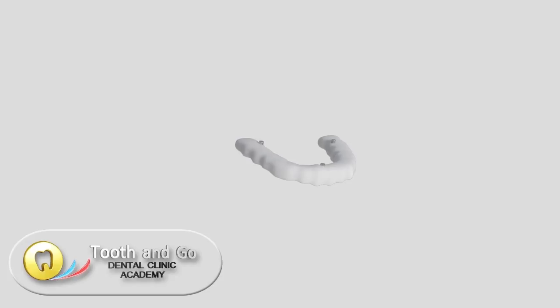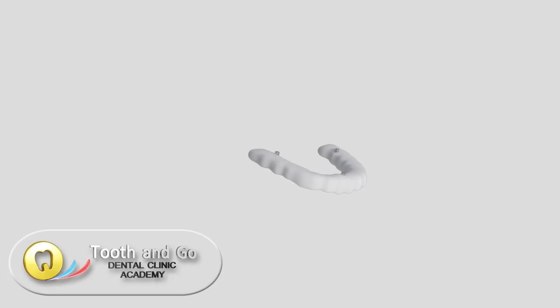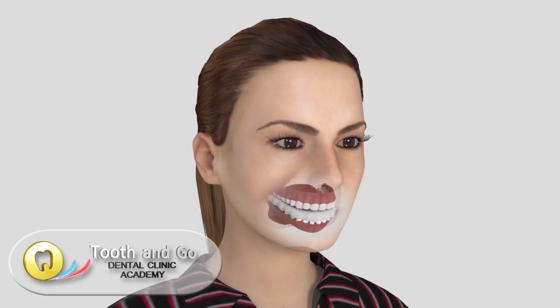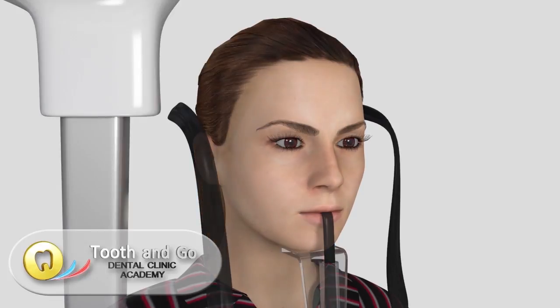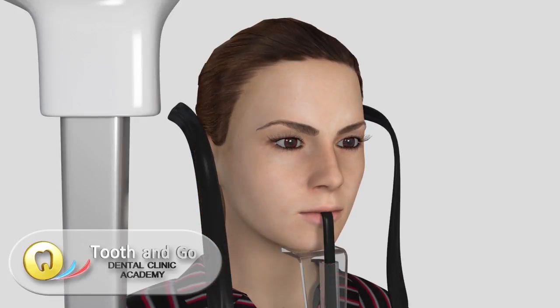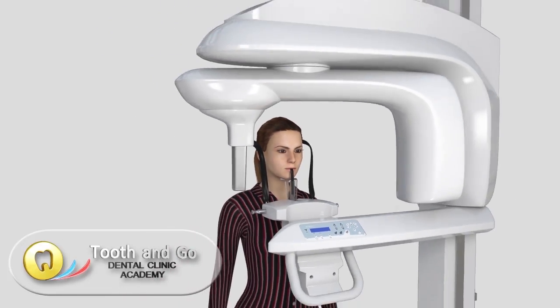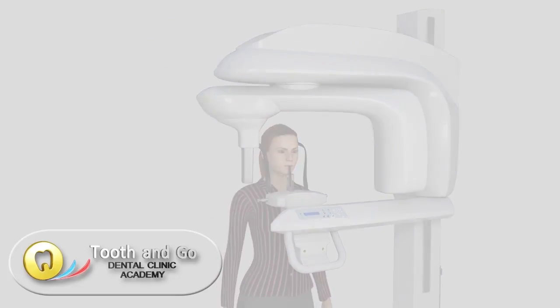A laboratory-fabricated scan template will be given to the patient to be worn during the 3D scan. Three metal pins inside this template serve as reference points.